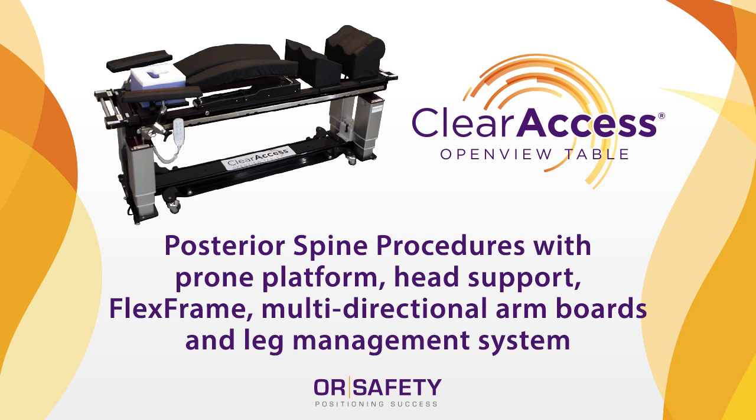This video includes an overview of the entire new standard package and detailed setup instructions for the clear access table base, prone platform or open top, flex frame or Wilson style frame, multi-directional arm boards, thigh pad and ankle rest.